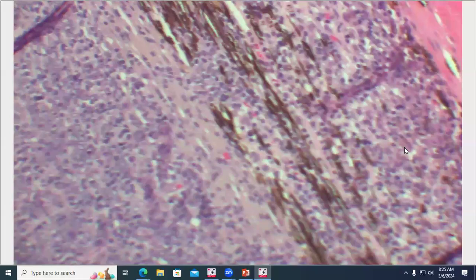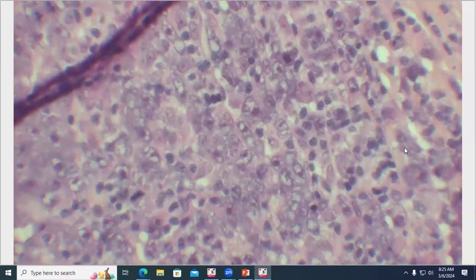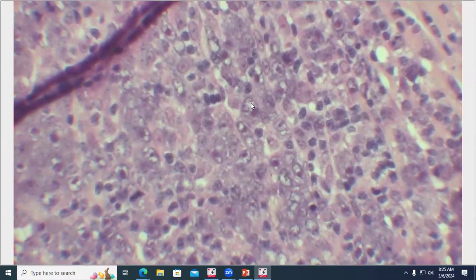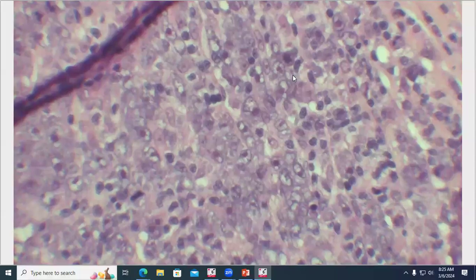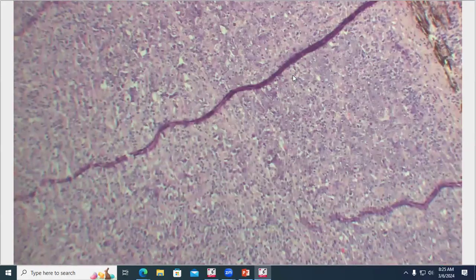And then you can see the difference between these larger round cells that are our neoplastic population. We've got small amounts of eosinophilic cytoplasm. These nuclei are really big and round to oval, at least two times the width of a red blood cell. We've got a prominent nucleolus. Mitotic figures were pretty common to find in this tumor. And with the circumferential nature and it being very destructive, this is pretty typical of lymphoma.